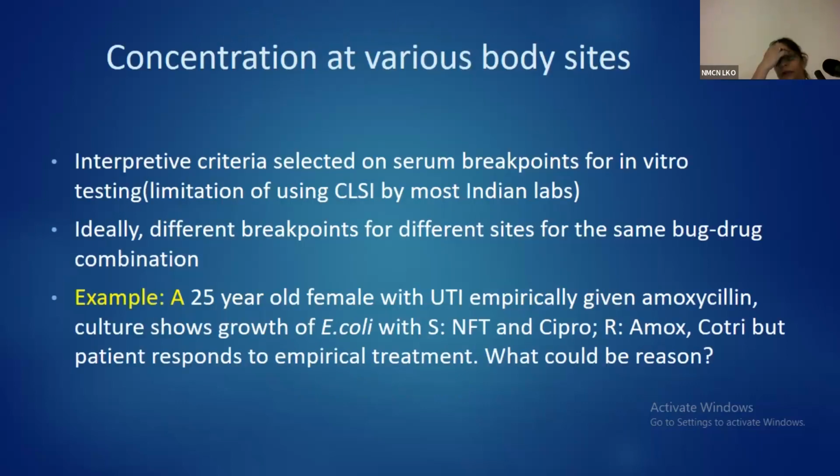Similarly, regarding MIC, we know that MICs in CLSI standards have been based on serum breakpoints. That means they are based on the levels which are achievable in serum and which would likely result in clinical success. So interpretive criteria given in CLSI are based on the serum breakpoints for in vitro testing. Ideally, different breakpoints must be there for different sites of infection for the same bug and drug combination.